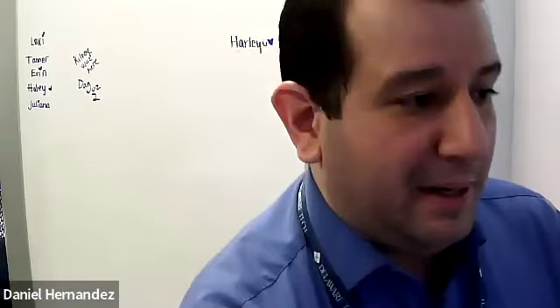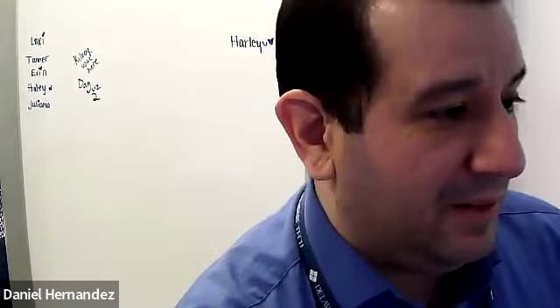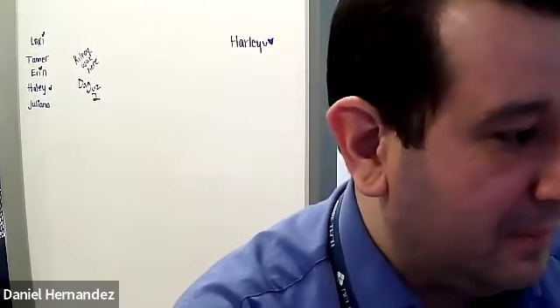So it's a good example of an appendix that's probably tortuous. So I'm in that kind of oblique orientation, and I'm picking up two parts of the appendix. So this represents the tip, and then we're getting another little piece of it here. So it's probably diving down, and then coming back up.